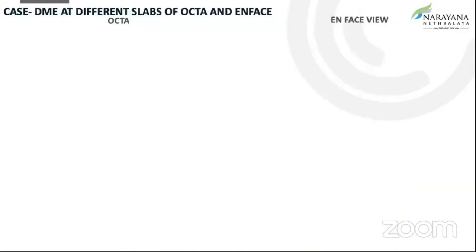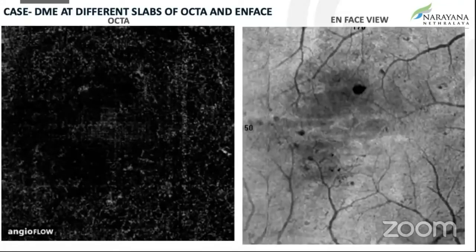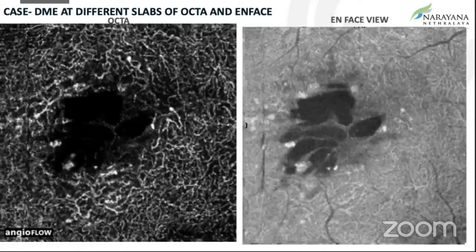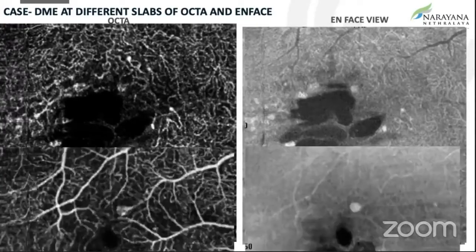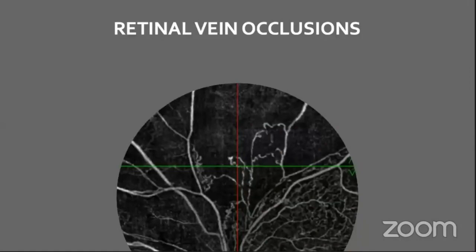If you look at the DME across the different slabs of OCTA and compare it with the en-face, this is how you see it in the outer retina, and this is the deep DCP — you can see it is so well compared. We don't tend to see the en-face that often, but it is definitely helpful. And this is the superficial plexus.